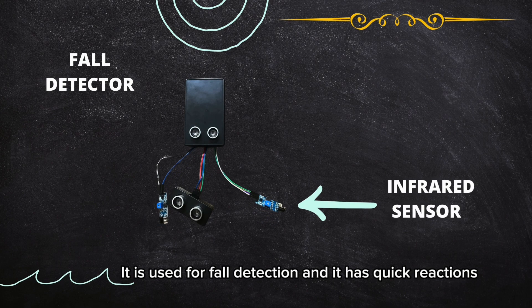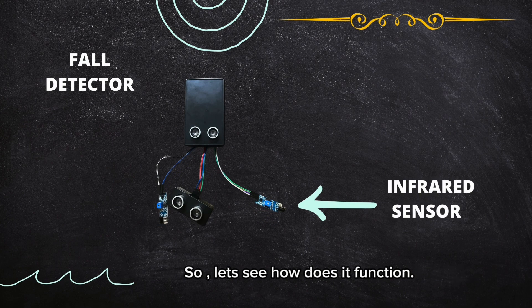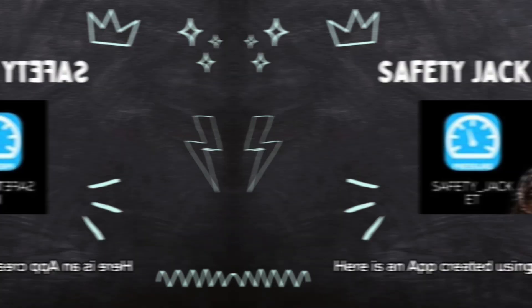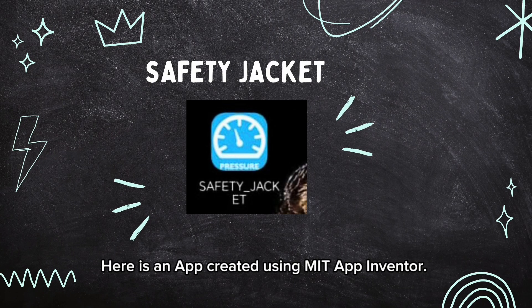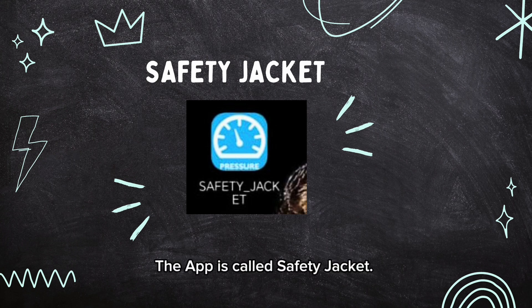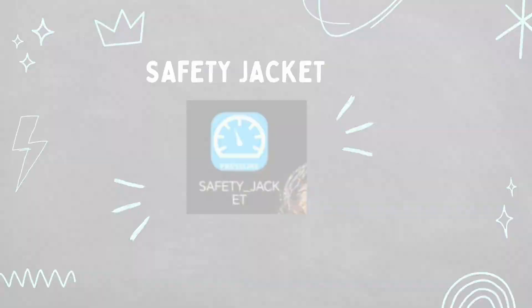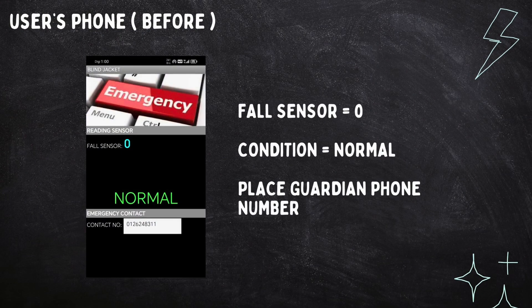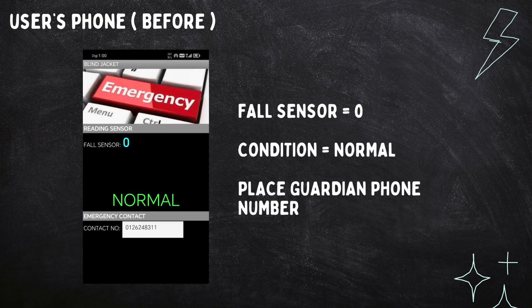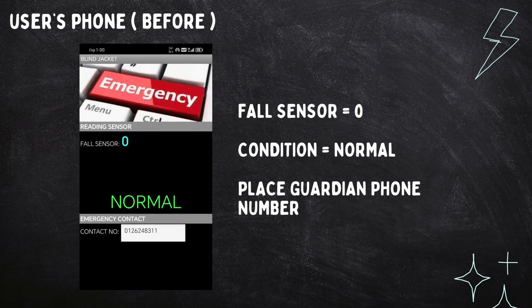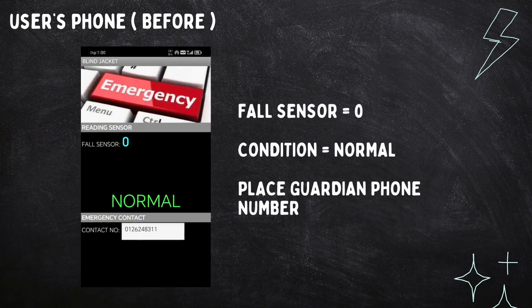This is the infrared sensor, which is used for fall detection and has quick reactions. Here is an app created using MIT App Inventor. The app is called Safety Jacket, and its purpose is to have a connection between the guardian and the user. Here we are in the Safety Jacket app — the fall sensor is zero and the condition is normal.